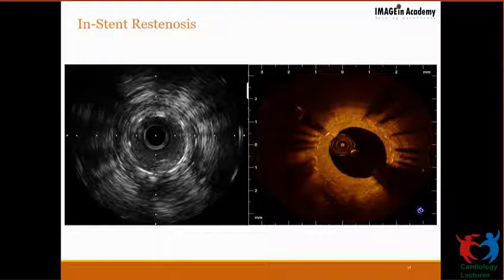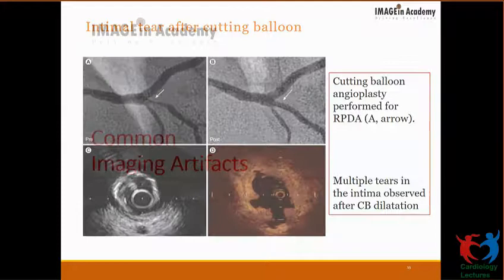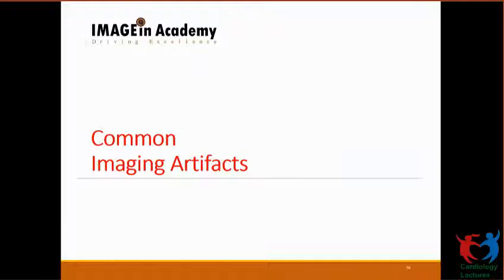Vis-a-vis OCT. Well, needless to say about the surface details, that is malapposition, dissections, plaque prolapse, nothing will be seen on IVUS, but OCT, by virtue of giving you magnified images, will show you all.